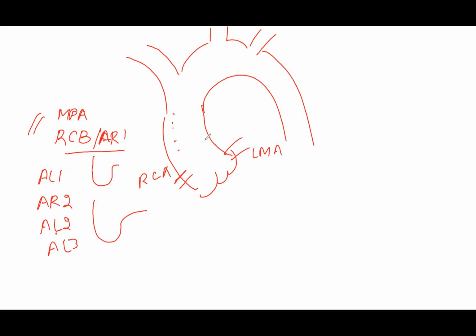For the left-sided grafts, I prefer to use RAO. The reason is that on the RAO, the aorta will turn and you can see the grafts coming out from the right aspect of the screen, or the left side, because they're coming from the anterior aspect, right?